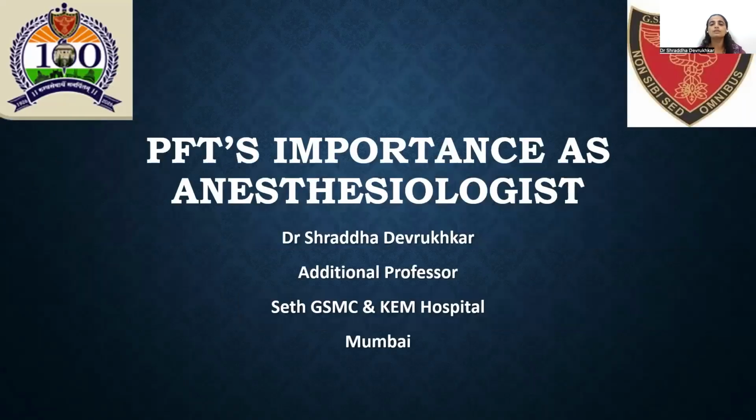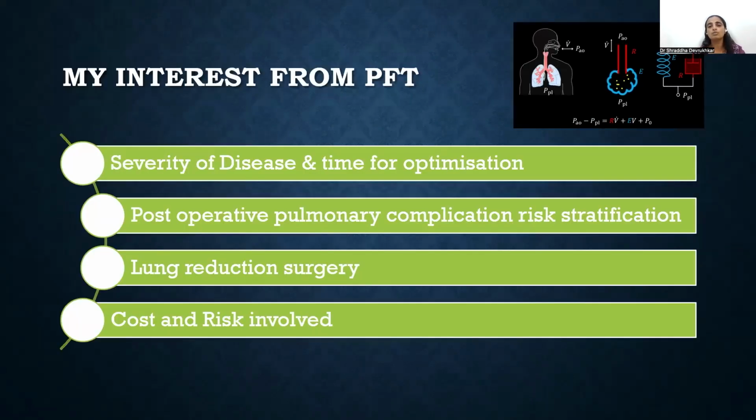So the topic for me today is pulmonary function tests and their importance for anesthesiologists. So what is my interest? Why do I want to do a PFT? PFT is otherwise very time consuming. When you ask for a PFT, it is not as easy as getting an ABG.